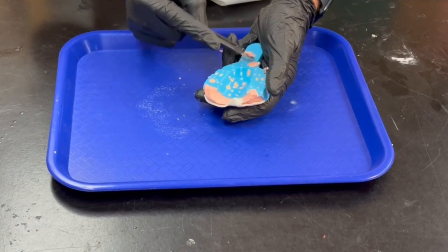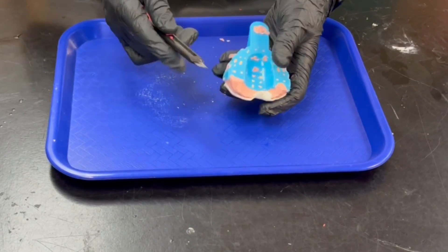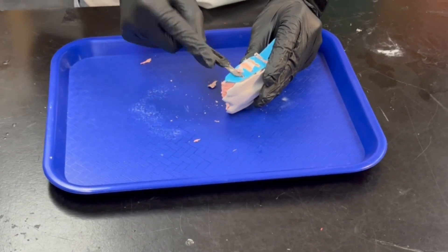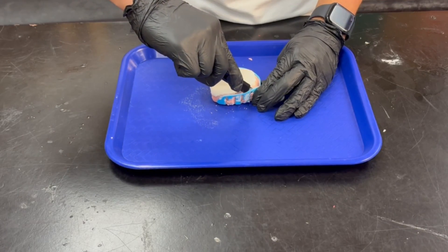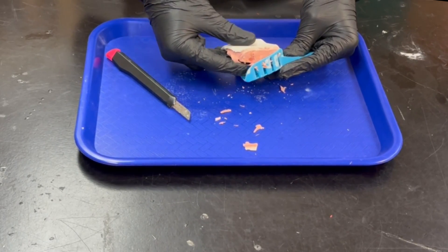This is a really important part, so let us explain what we will do. To separate the impression, we will start by carefully removing the extra cavex hanging on the sides. Ensure you go with the cutter and remove all the excess leaking through the little holes. Then insert the cutter in between the cavex and the tray to slice it around, and your impression should easily come out of the tray.